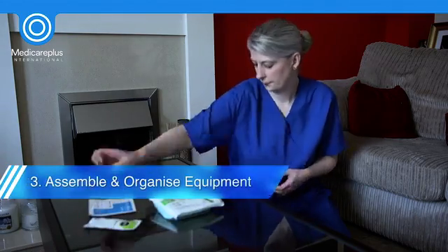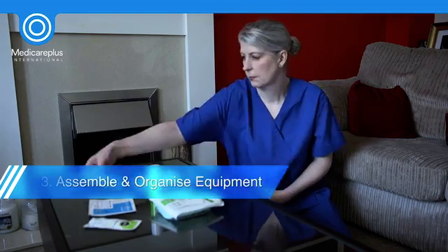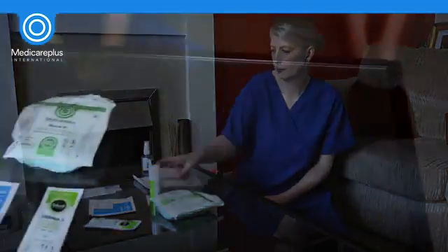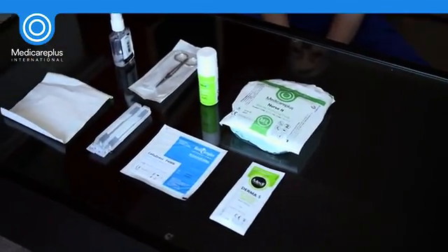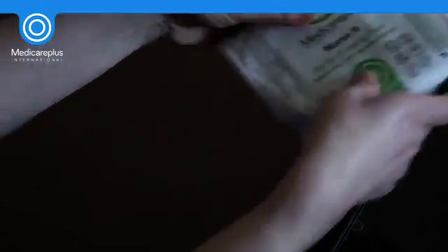It's now time to assemble all your equipment, including your dressing pack and suitable dressings and any other items deemed necessary such as sterile scissors and forceps. The use-by date of your dressing pack and other equipment should be checked before opening.